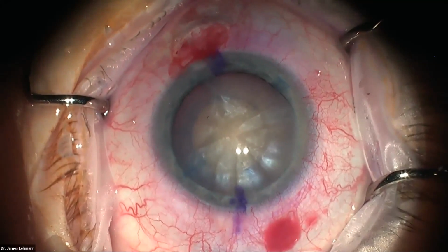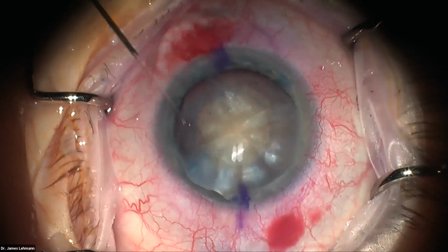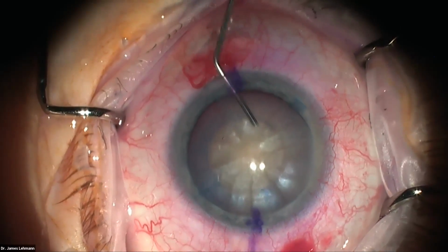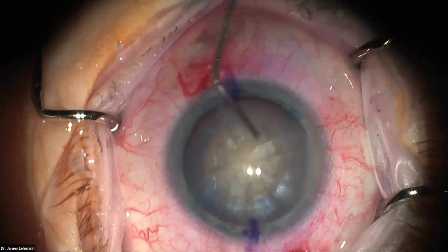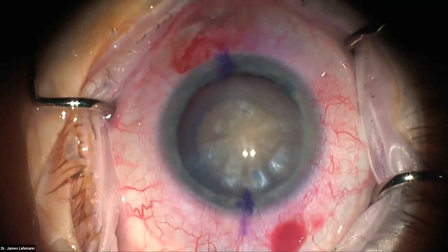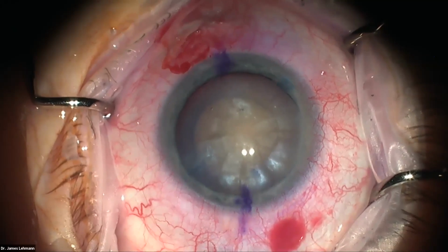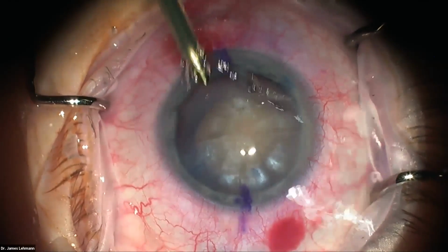Okay, so now the other thing that I learned when I was in residency was you do not have to do hydrodissection of a mature nucleus. So that cortex has already been liquefied. And so I'm not going to do any aggressive hydrodissection here, just a little bit. And then I'm going to be able to show you that you can rotate the lens fine, see? So again, you can make a mistake, as capsules can be real friable in mature lenses. And so if you're too aggressive with hydrodissection unnecessarily, you can cause a blowout of the posterior capsule.